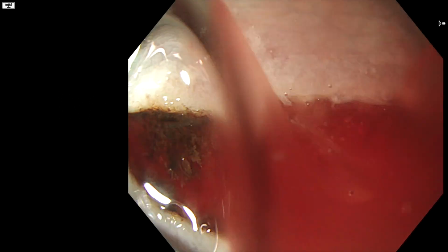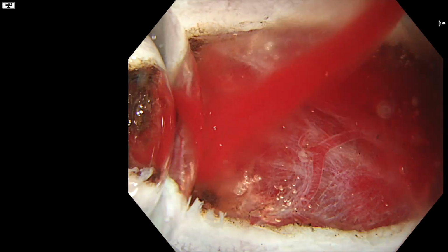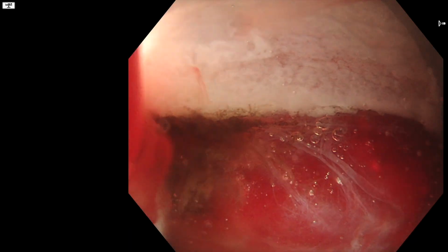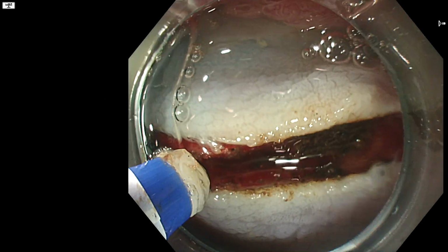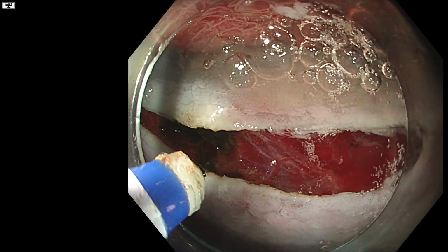You would be forgiven for asking why on earth I decided to try a new knife that I wasn't familiar with on such a complex lesion. And the honest answer is that I have no idea, but I suspect I probably underestimated the complexity of the lesion, seeing as that's something I'm still very prone to doing, unfortunately.